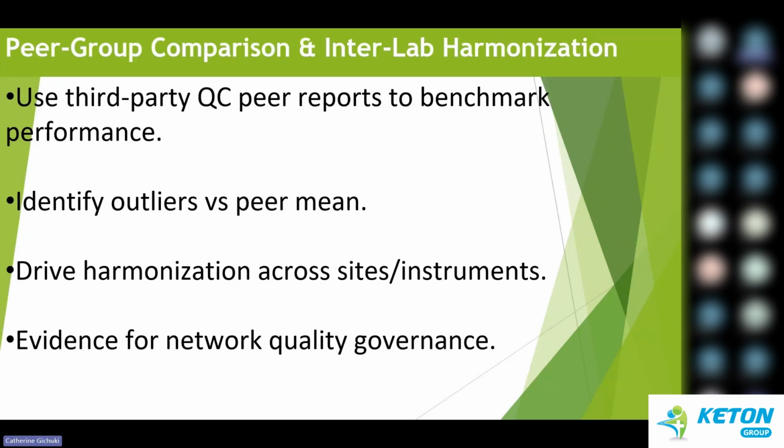For example, you're reviewing results and you notice all sodiums are giving a 130, a 131, a 132, all low. When you go back to the LJ, which is advisable to check before you start reviewing, you want to see how the LJs are. If you go back, it's going to show you a signal that clearly even the QC is reading low. So it's able to signal a possible problem.